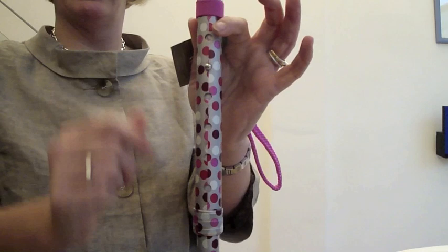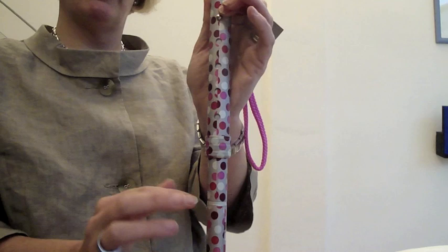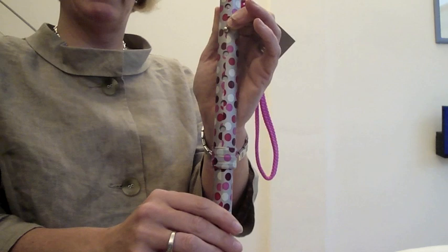One thing to point out is you can remove the ferrule on the base and cut up to three inches off the stick for somebody who's quite tiny, but that's just an option.